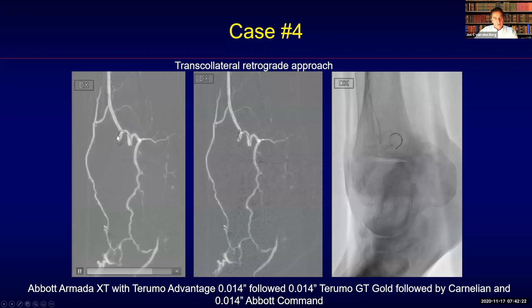Here you can see advancement of both of them. The Armada XT is following the tortuosities quite nicely and the second loop is also relatively easy to follow, but then we had some issues getting control with the Terumo Advantage guide wire — it was not possible at all to go into the collateral, and the wire continued to go into another side branch of this large collateral.